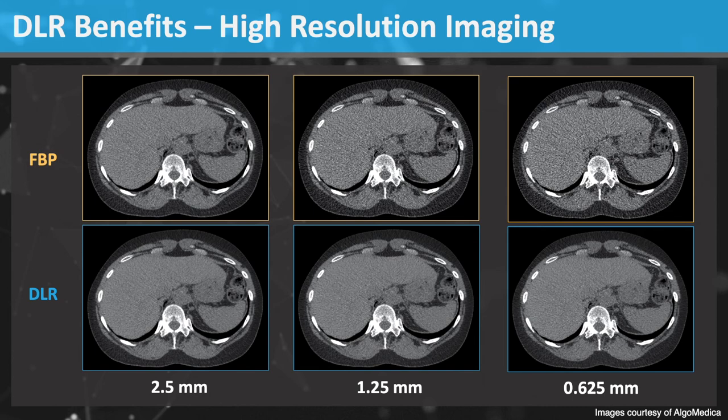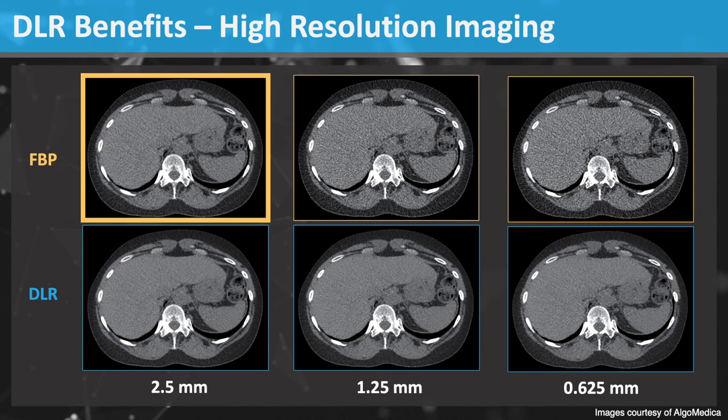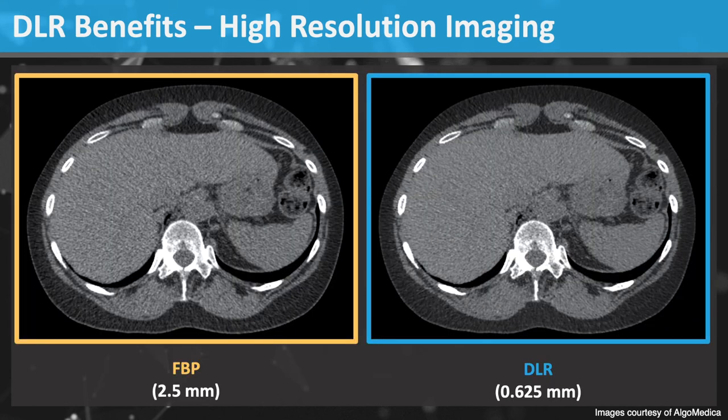However, the image quality with DLR is maintained, even with thinner slices. Now let's compare 2.5 mm slice thickness with filtered back projection to 0.6 mm slice thickness with DLR. If we take a close look, the thin slice images with DLR have similar image quality. DLR does not obey the normal rules of slice thickness and allows for high resolution CT imaging with minimal or no penalty.